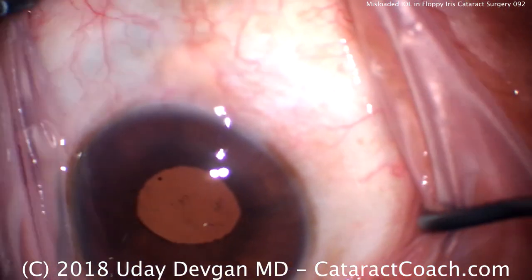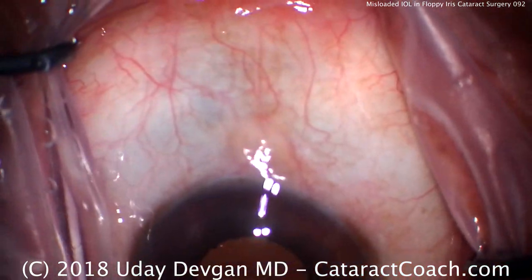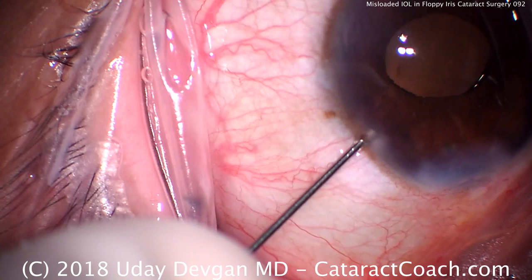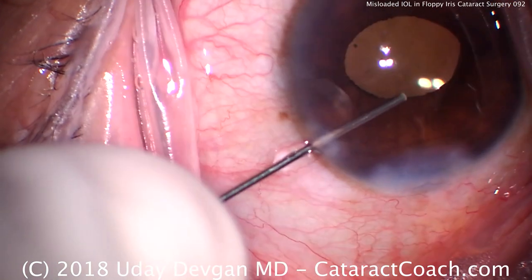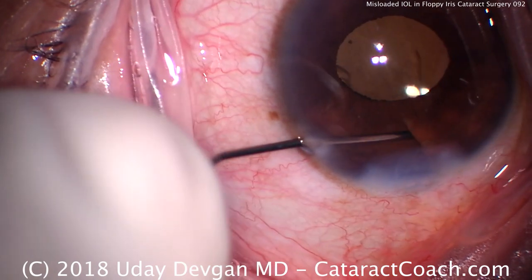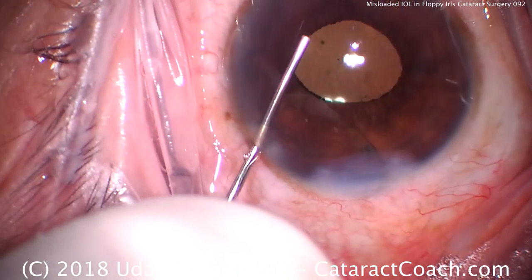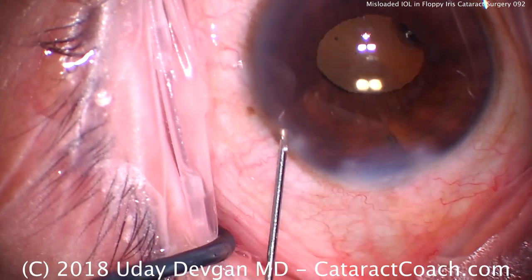Now through the side port — the patient's not so cooperative here — we'll refill the AC and deepen it, ensuring that we don't have any iris stuck in that temporal incision. We also get out some residual viscoelastic. That looks pretty good — we're going to seal that up and call this a day.